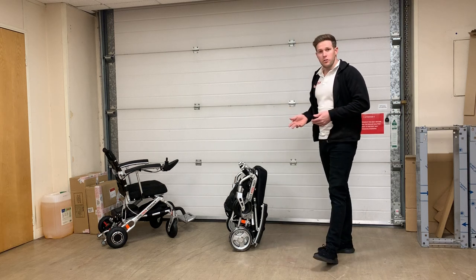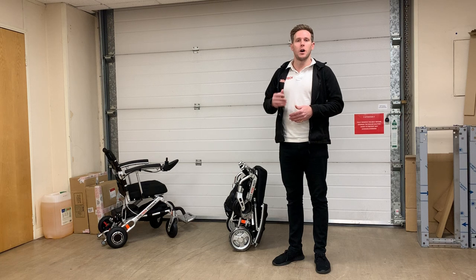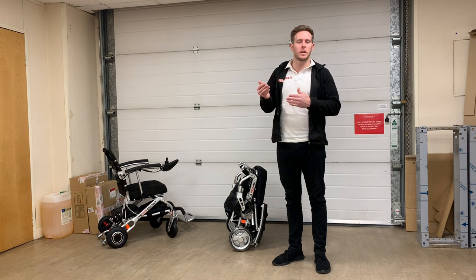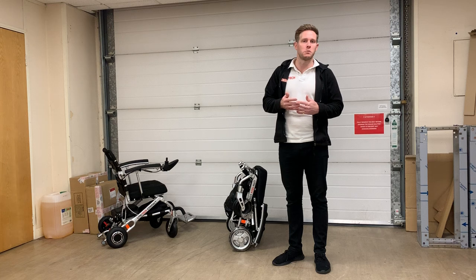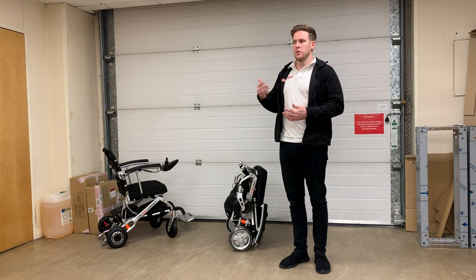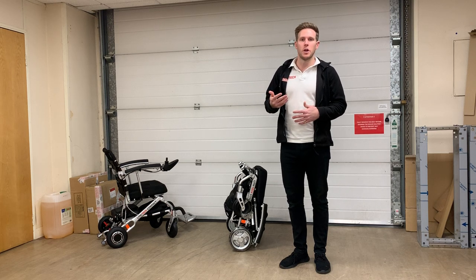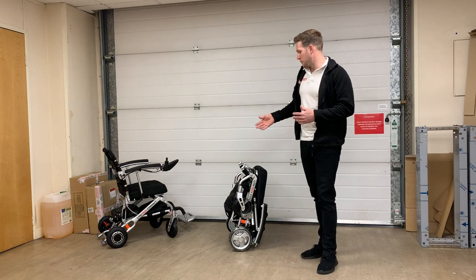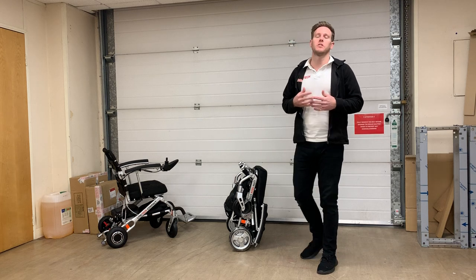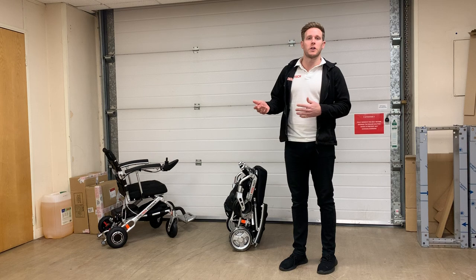It's also good on hard grass. It can still handle kerbs, but we need to find drop kerbs rather than full-length kerbs like you can with the smart chair range. Obviously with every wheelchair there's going to be some sort of a compromise — the smart chair ranges are heavier with bigger wheels, whereas the demographic buying this chair is buying it because it's so light and compact so they can simply pick it up and put it into the boot of their car.